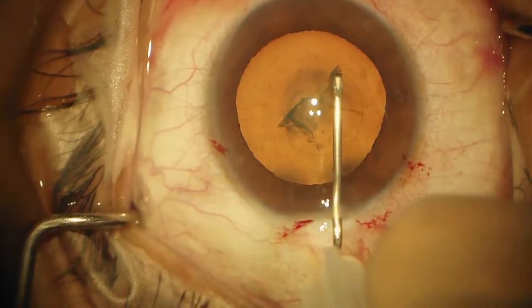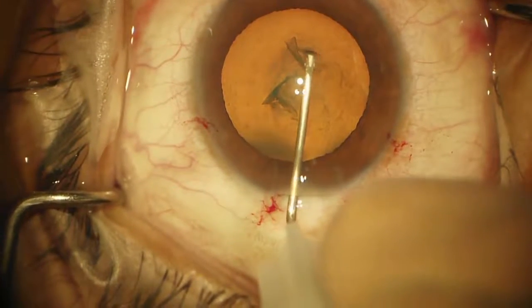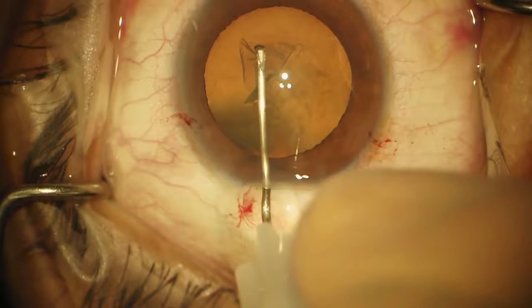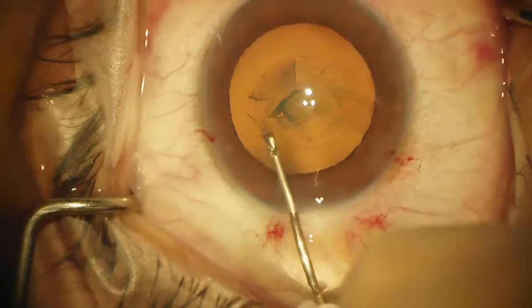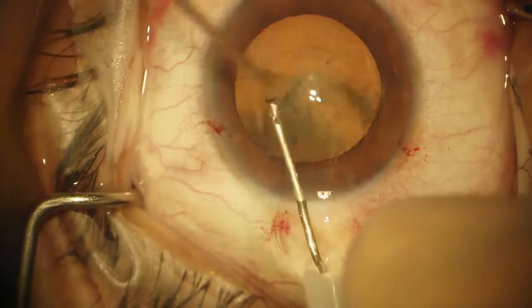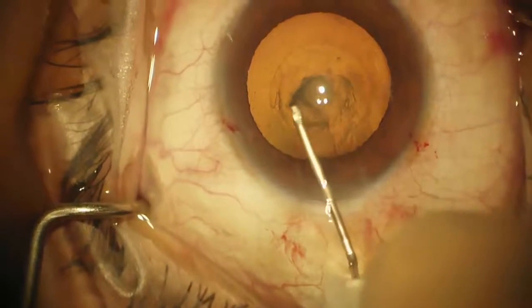I like to use the pupil as a template so that I try and stay the same distance away from the pupil all the way around for 360 degrees — that assures that we have a round and central capsulorhexis. You can see it's roughly the same distance all the way around, and that size is about five millimeters.